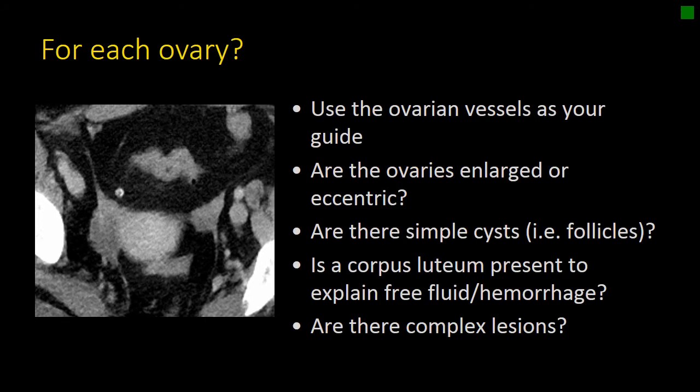Now let's discuss the ovaries. When evaluating the ovary, one of the biggest challenges that trainees have is just finding and identifying the ovary and distinguishing it from adjacent structures, such as bowel, lymph nodes, or vessels. I really like to use the ovarian vessels or the gonadal vessels as my guide — following them down the retroperitoneum right up to the ovary. You can also use the round ligament to triangulate with the ovarian vessels to find the ovary.